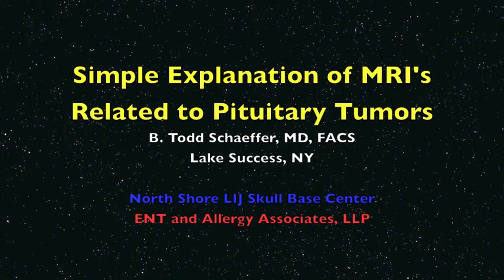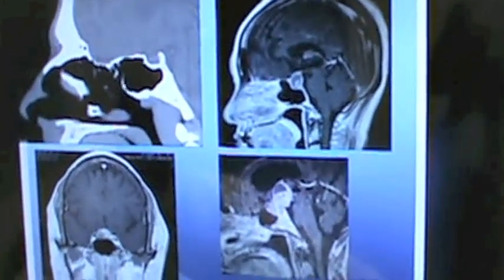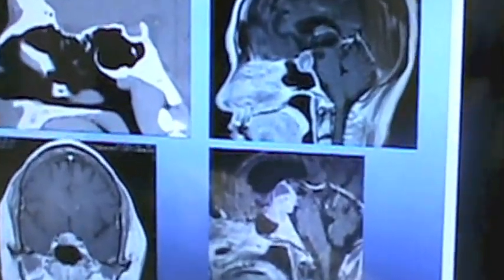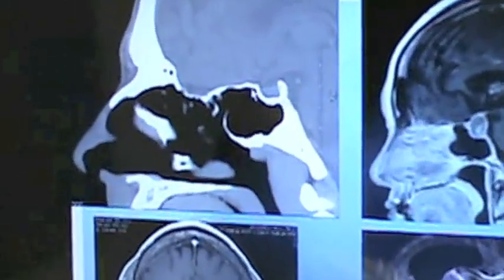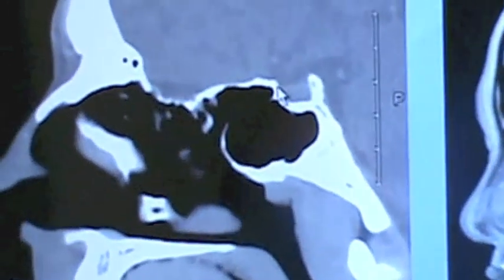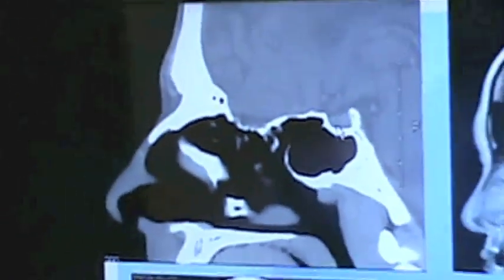The following is a simple explanation of MRIs related to pituitary tumors. This is the side view of the nose. This is the sphenoid sinus. This is the normal pituitary gland — you can see the gland right there. It's about the normal size.